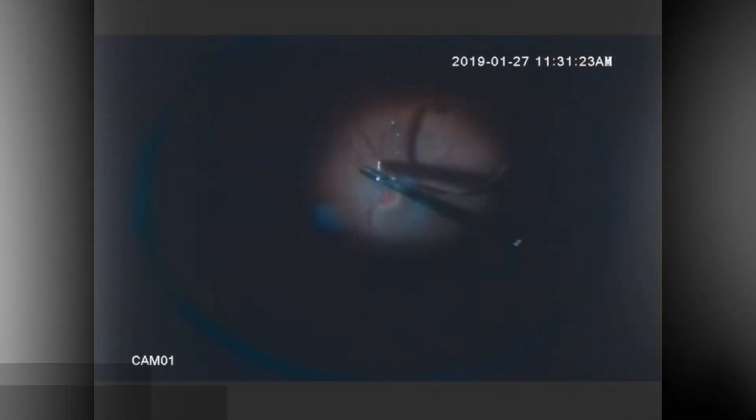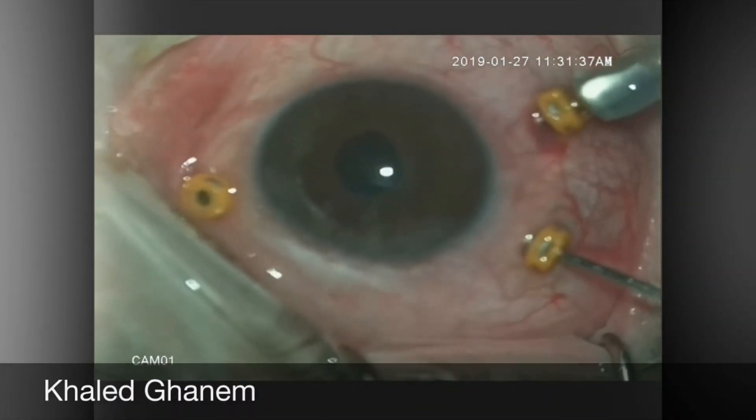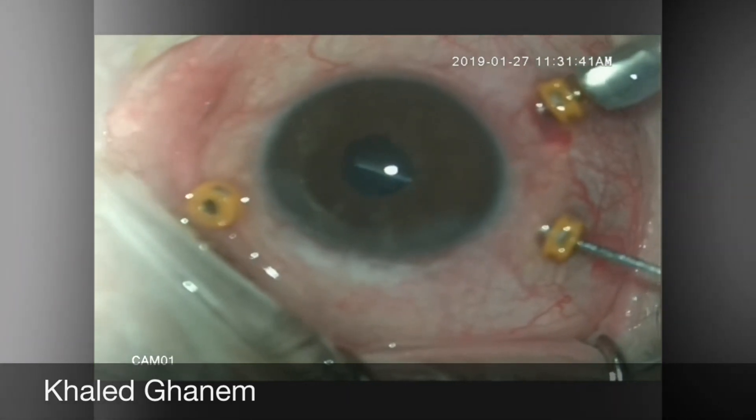Here is another case. After complete vitrectomy is done, the IOL will be picked up with the forceps and raised to the level of the iris, and then the IOL will be completely delivered into the anterior chamber before explantation.